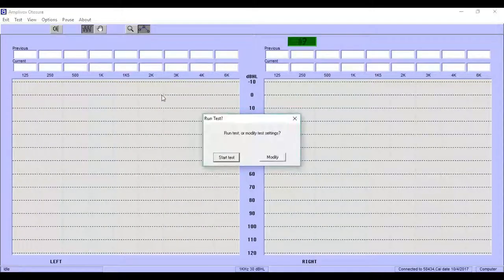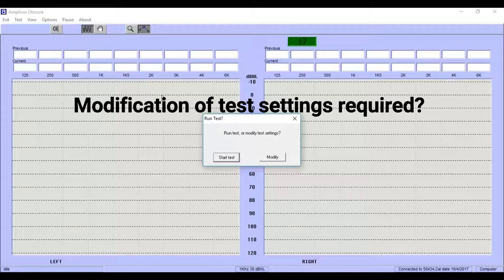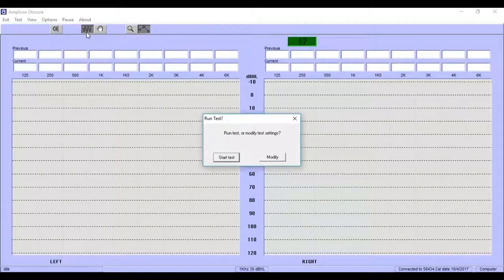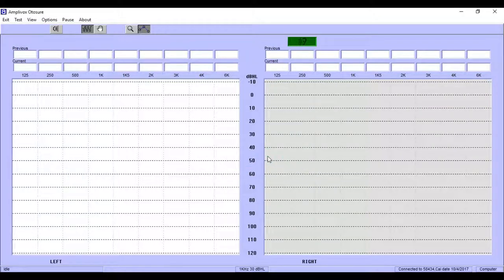After restarting the software, you will now be asked if an auto test shall be started straight away or if the settings shall be modified. We select modify to change the test protocol according to the HSE standard.